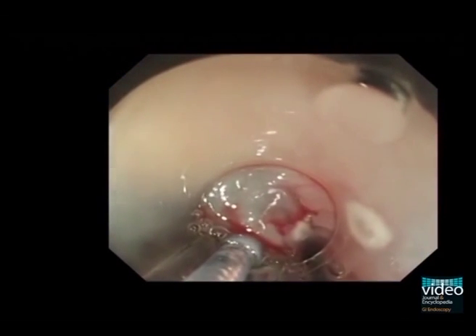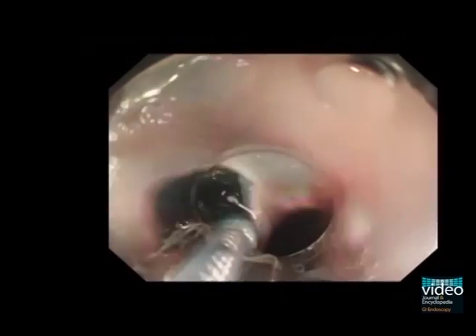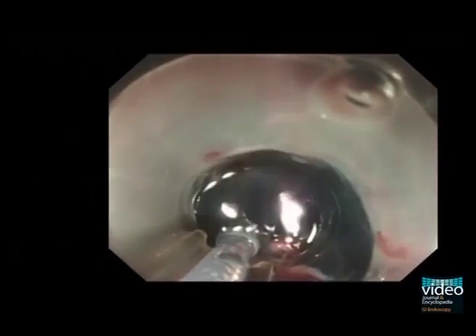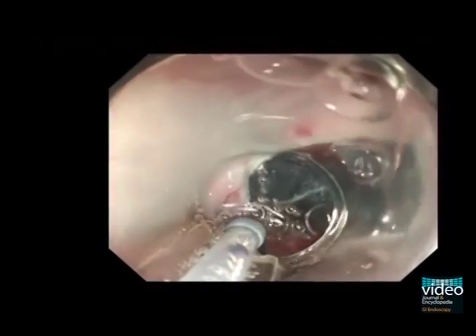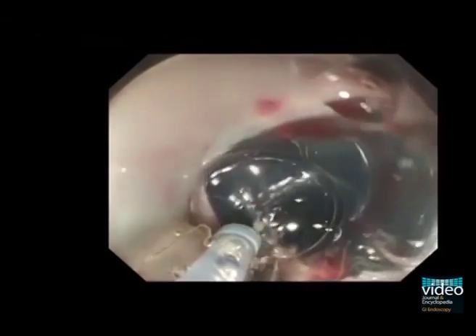The submucosal dissection was started with the rotation of the endoscope. The small calibre tip transparent hood attached to the endoscope tip was inserted into the thickened submucosal layer to maintain a satisfactory view. Using the small calibre tip transparent hood, the submucosal layer could be dissected safely while in constant view.